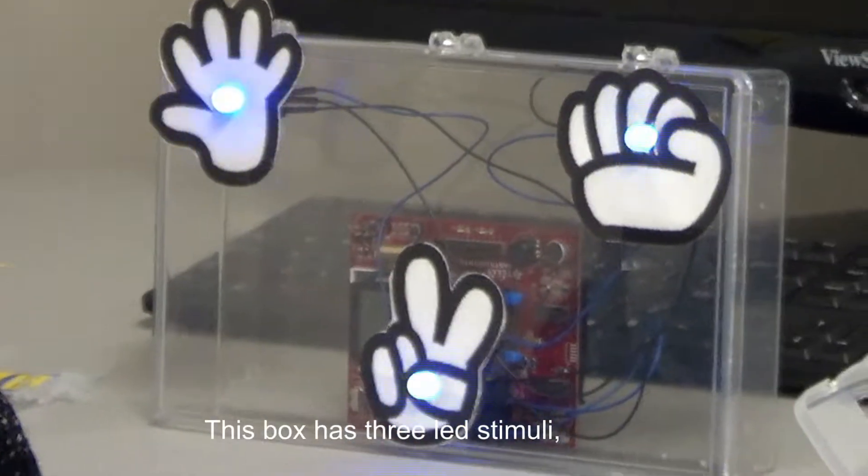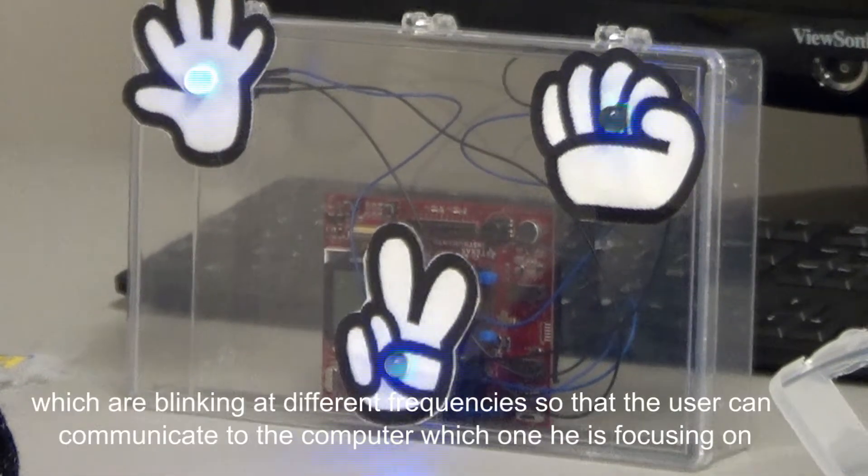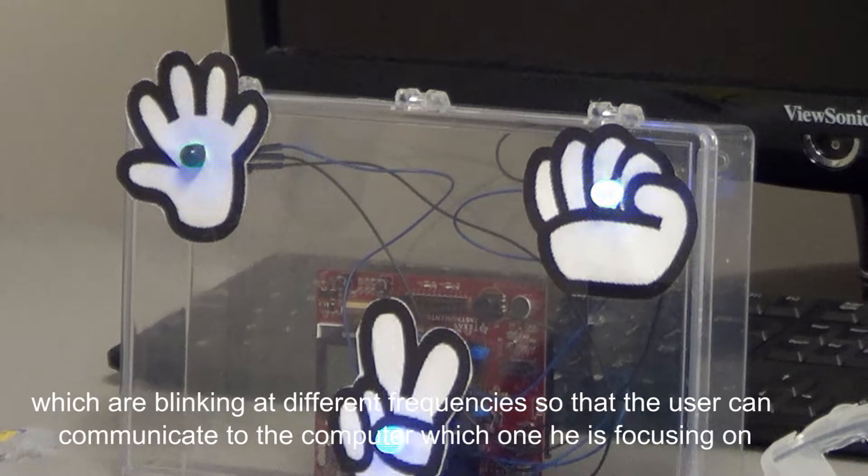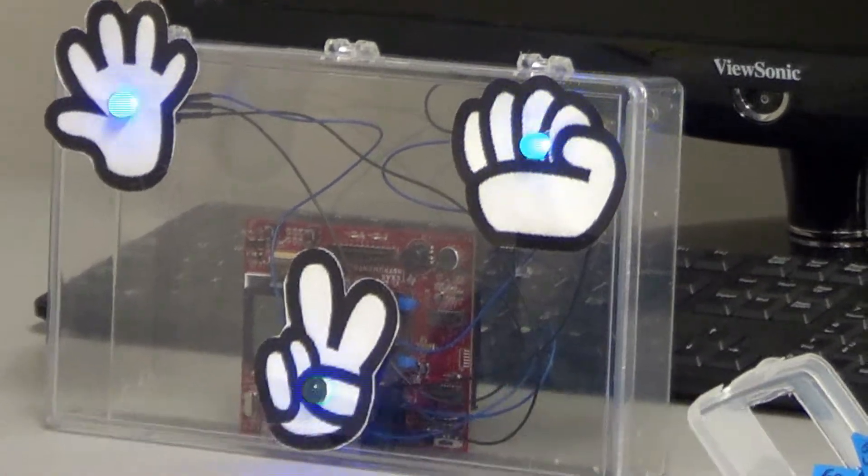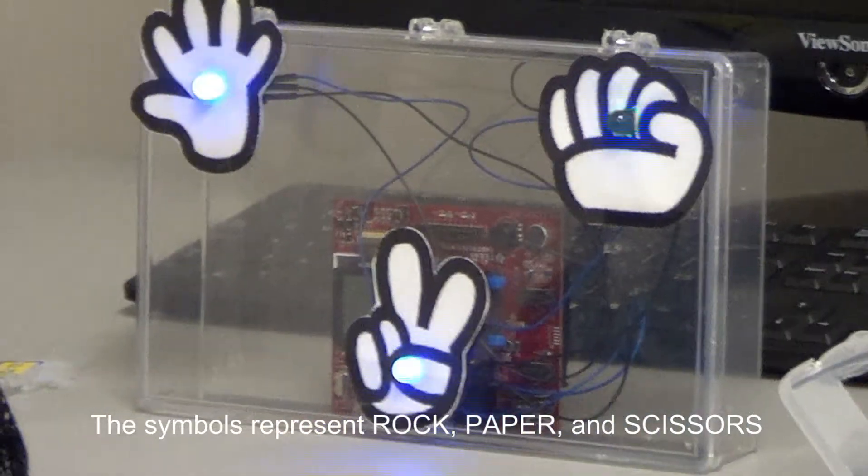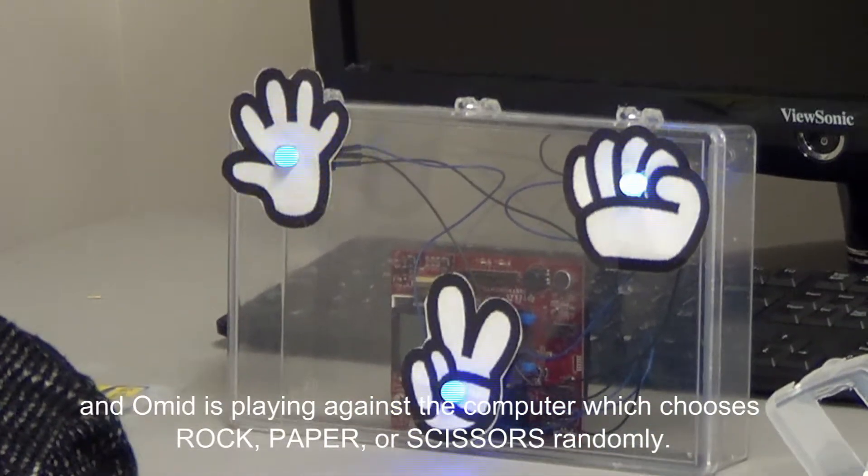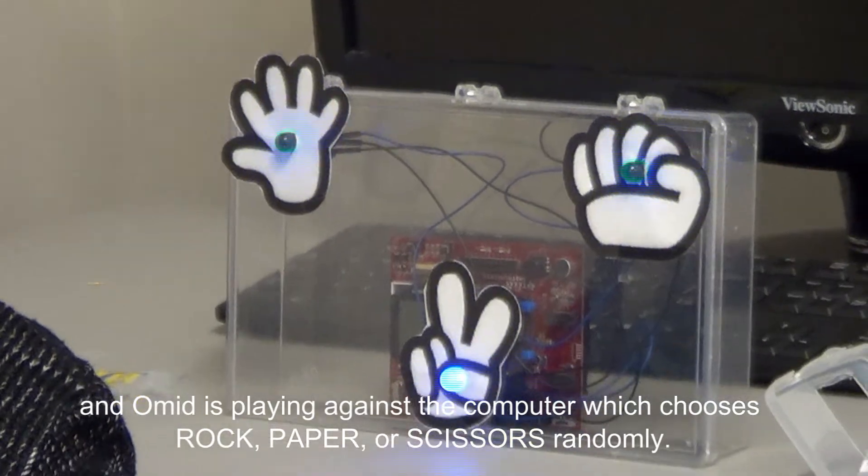This box has three LED stimuli, which are blinking at different frequencies so that the user can communicate to the computer which one he is focusing on. The symbols represent rock, paper, and scissors. And Amid is playing against the computer, which chooses rock, paper, or scissors randomly.